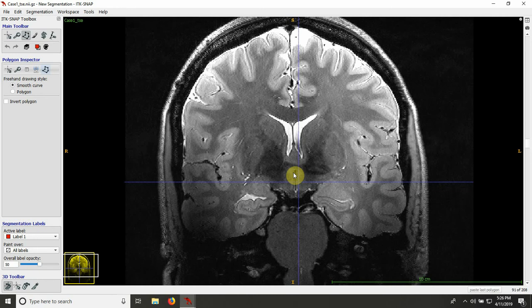Hi everyone, my name is Laura Wisse and today I'll be talking about the quality assessment of T2-weighted images specialized for MTL segmentation. And I actually get asked a lot the question of how to assess these images.